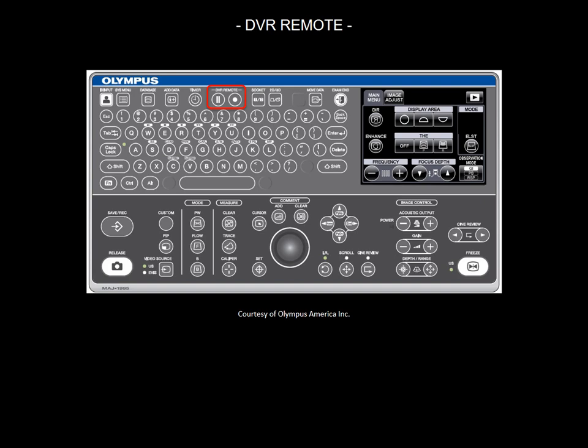The DVR remote allows you to record your exam using an external digital video recorder.